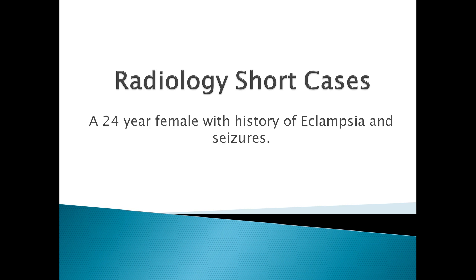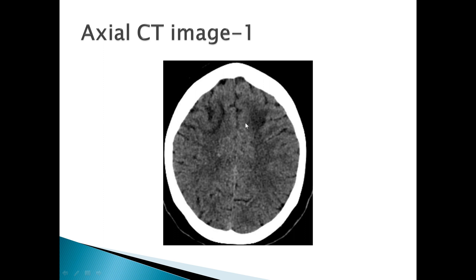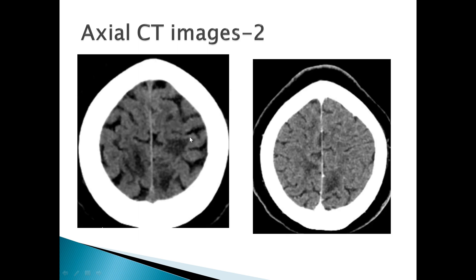Hello friends, welcome back to Radiology Short Cases. Today we have a neuroradiology case: a 24-year-old female with history of eclampsia and seizures presented in emergency OPD, and her NCCT head was performed. On CT we can see ill-defined hypodensities involving bilateral frontal lobes, predominantly within the white matter. A second set of images shows almost similar findings — ill-defined white matter hypodensities involving frontoparietal lobes in a parasagittal location. Findings were substantive of vasogenic edema.